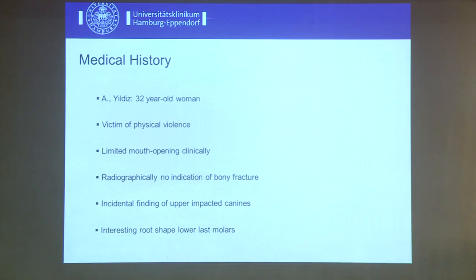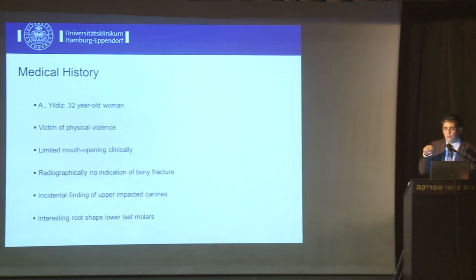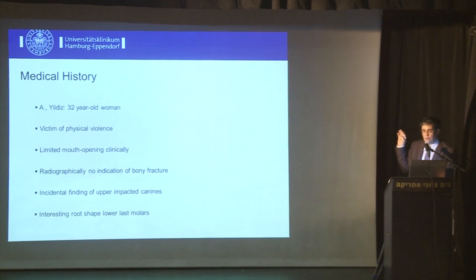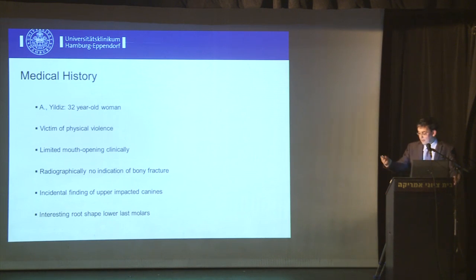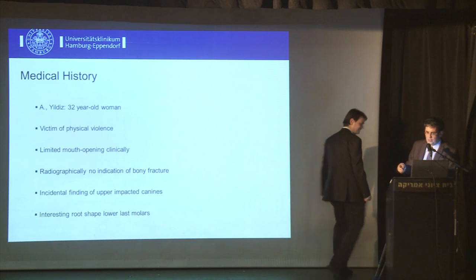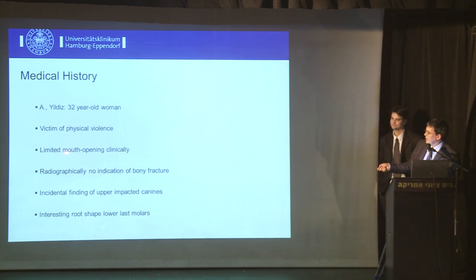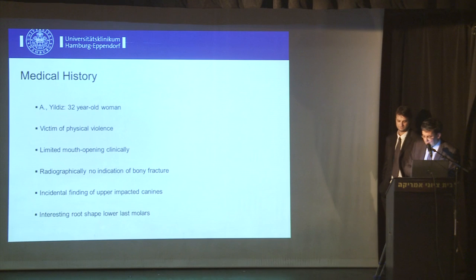This is now the point where we could start with the first dataset. We have a victim of physical violence — a patient from our department — she has limited mouth opening. We will see no fracture, but we will find some incidental findings. This is exactly the point: if you make an image, you have to look at every structure within your volume.